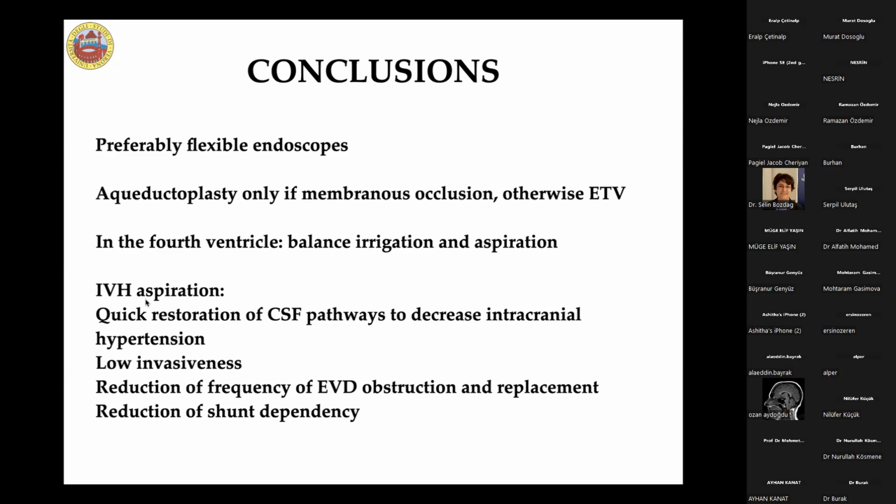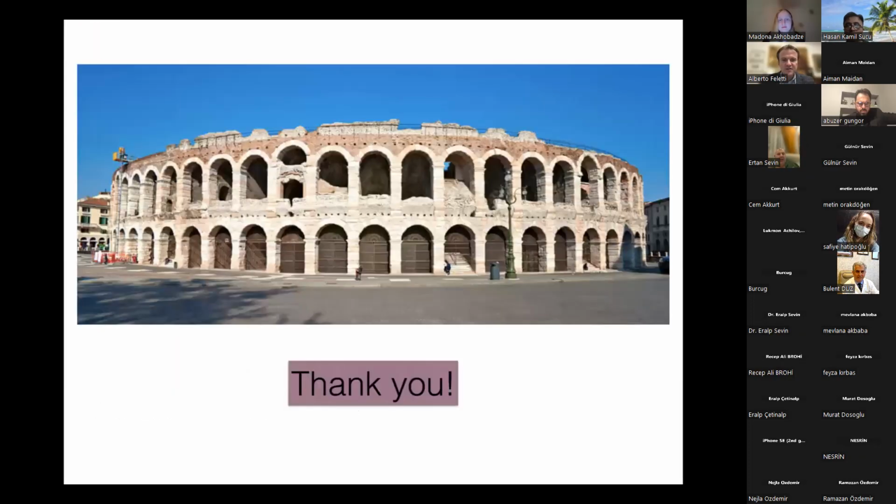And IVH aspiration can allow a quick restoration of CSF pathways and decrease intracranial hypertension. It is a very low invasive technique, and with this method, we can reduce shunt dependency of our patients. Thank you very much for your attention, and any question is very welcome.